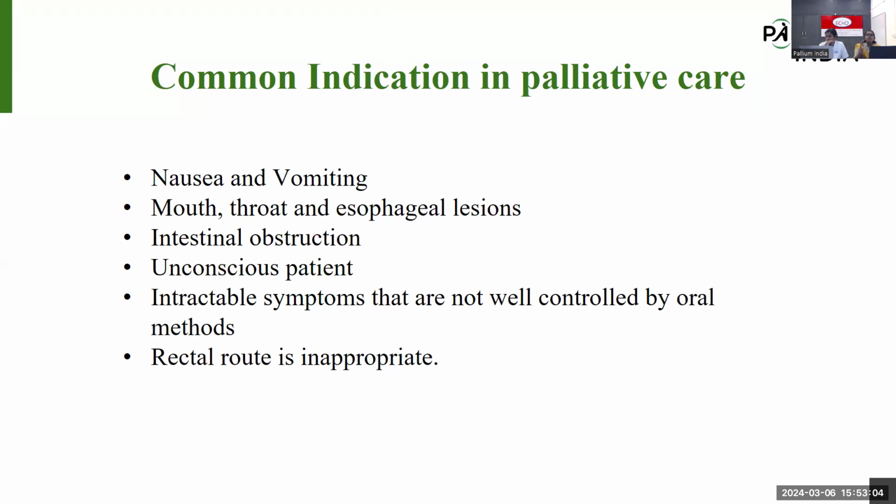Otherwise, they will come to you all of a sudden and say, oh, the edema is there. Usually after an intravenous line, we tell them, if there is any edema formation, please tell us as soon as possible, because we need to change the needle site. But here the edema is normal, so we need to tell them.